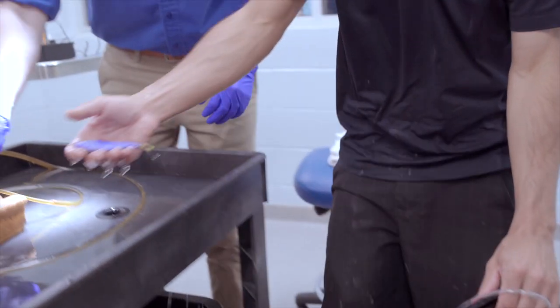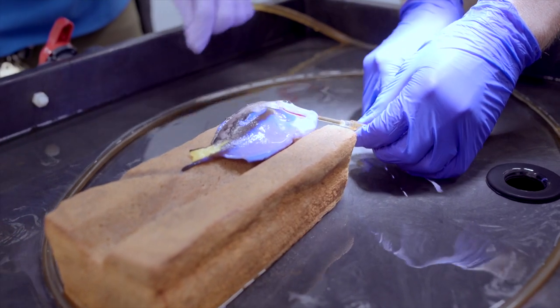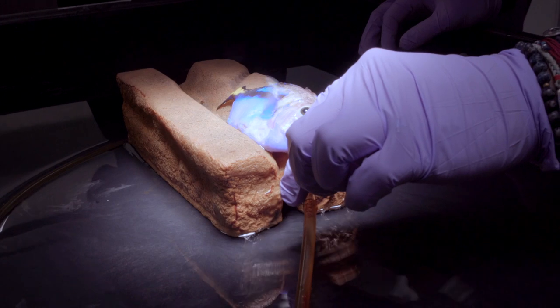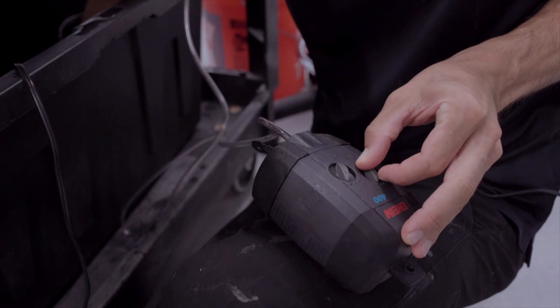We'll then transport him to our specially designed fish anesthesia table, which will allow us to better access his body while we're working on it. The tube down the patient's throat just provides a continuous flow of anesthetic water.